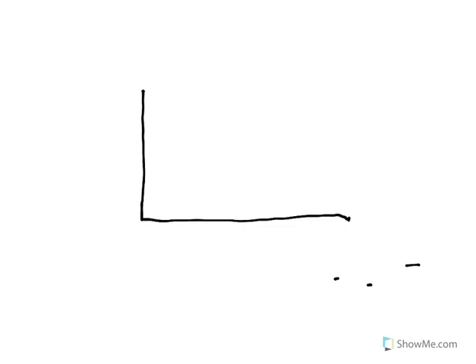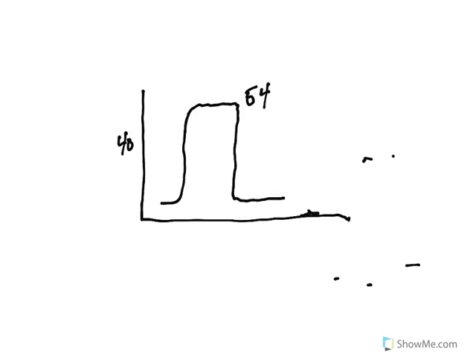All right, so some of the other things that we could be looking at. As far as acidosis and alkalosis goes, we kind of talked about that. So generally, when I see this really high, and let's say this is at 54, okay? Whatever, 54, you get it. It's up there at 54. We would say that our patient is experiencing some respiratory acidosis, okay?